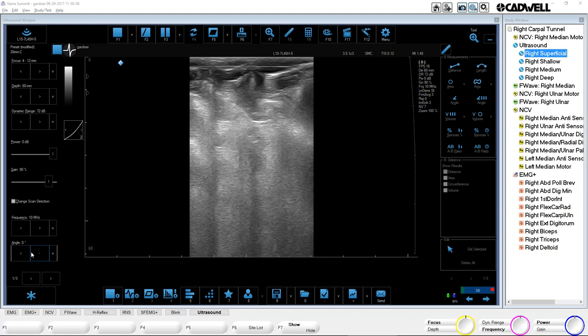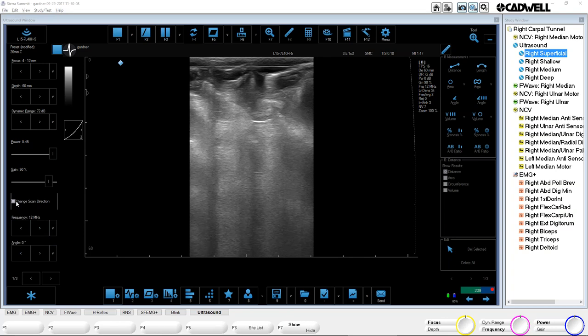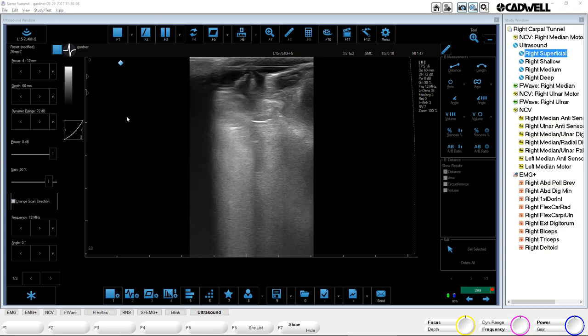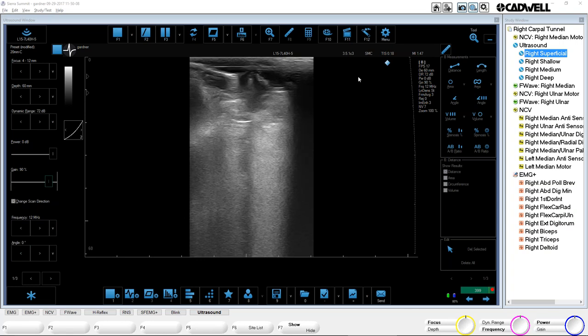Change scan direction — this is important. On the probe, there's typically a symbol on one side or the other. The easiest way to know what side is what is just tap the probe. I'm tapping the left side, so I know that's the left side of the screen. On the Smartest, there's a little notch on one side of the probe, and that notch corresponds with a little diamond on screen. So I know that notch is this side of the screen. Change scan direction is going to reverse that — if I check that, the notch goes on the other side of the screen.